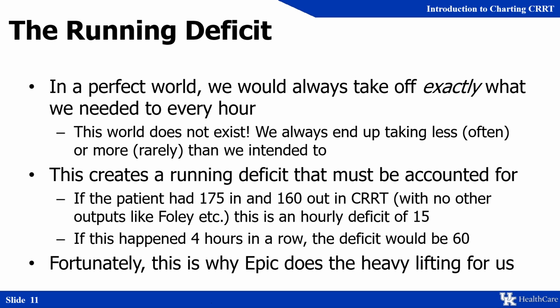This is why the flow sheet is important to do correctly, because it allows you to chip away at that running deficit slowly and gently over the coming hours. And it may take an entire shift or entire 2 shifts to get caught up from the running deficit, and that's okay. CRRT is all about slow and gradual.